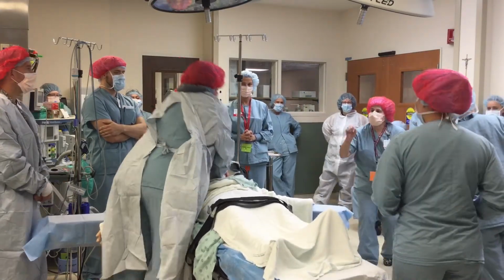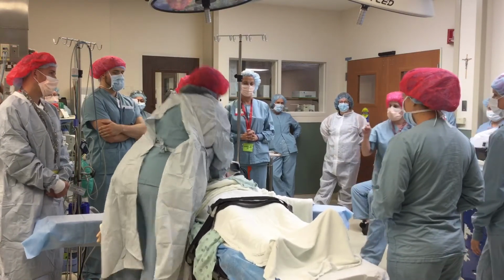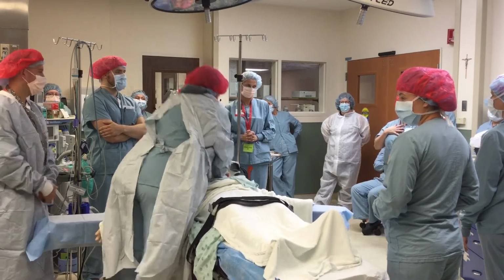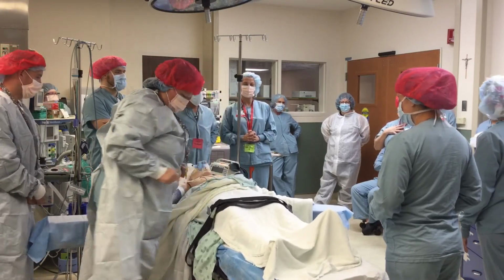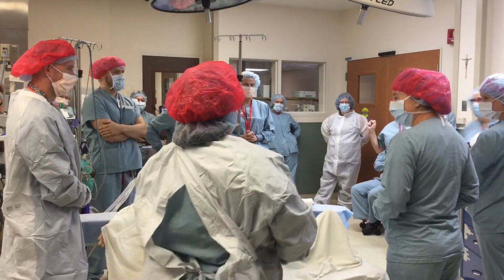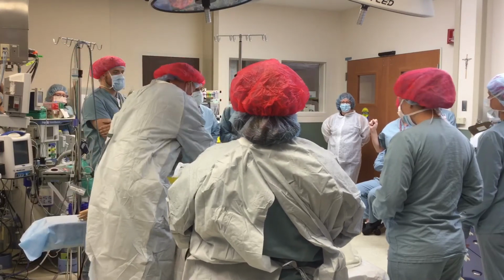How you doing, Tracy? 300. Do you need to change out on this one? Sure. Okay, Dr. Bone, I need you to step in. Alright, we are ready, clear. All clear. Shock. All right, good. Continue CPR please.